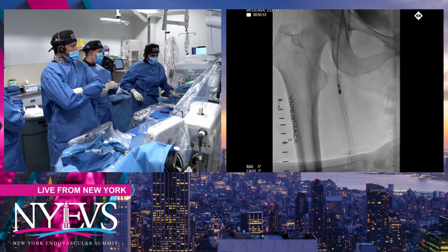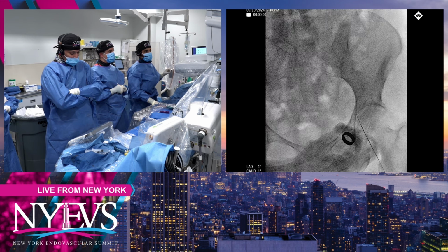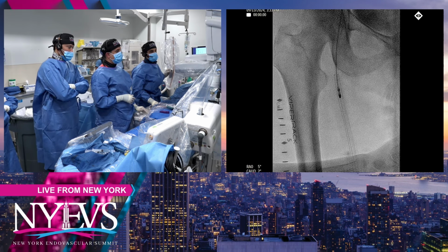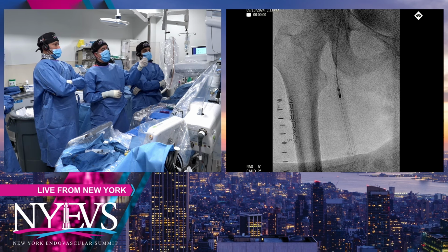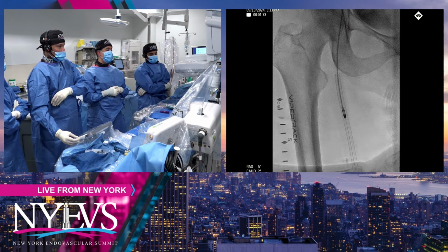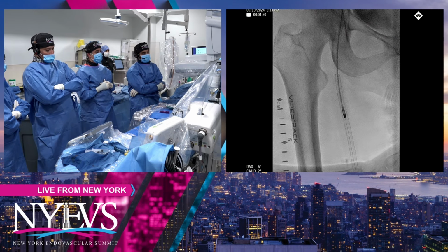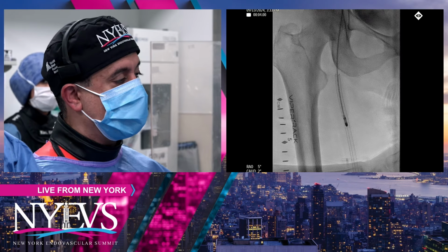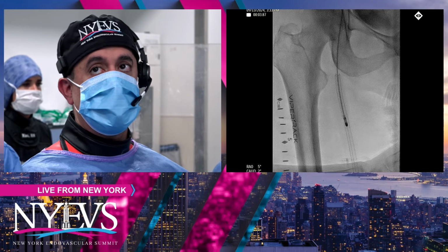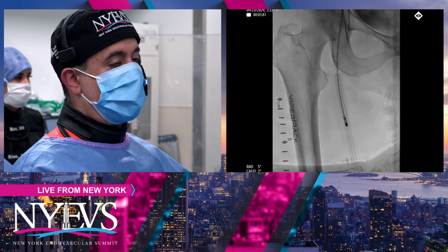So eventually, we decided we're going to give it one more shot, see how it behaves, after the dilatation, like you said. Yeah, after the dilatation, exactly. And we did the same thing, and it still seems to do the same thing. It kept doing the same thing. We had a little bit of progression, but not that significant. So at that time, we just decided to downsize and come to a 6 French Rotarex, which hopefully we're going to start right now. We're just waiting for the response. Hopefully, it might give us a little bit more purchase and not stall and not cause all the issues. But the PTA, like you rightly said, we tried to do that as well, but it would still not work.